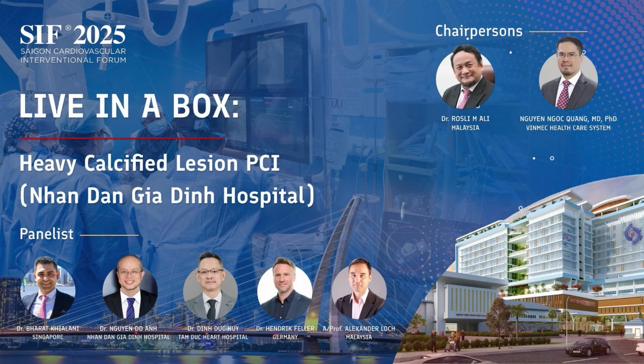at the ostium of the left main, and yeah, we may need a bigger balloon. So I think I will try maybe a 4.0 NC balloon first to see, or a 4.0 cutting balloon to see if it can work or not, because a second IVL can be so expensive. I don't know.